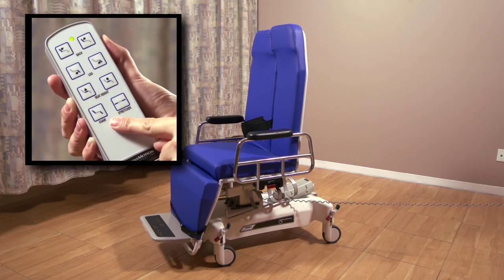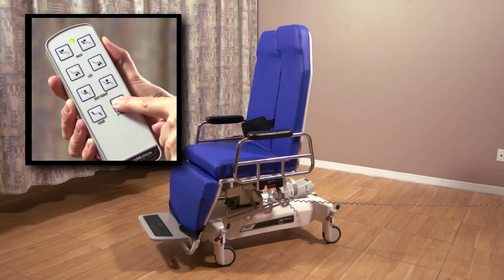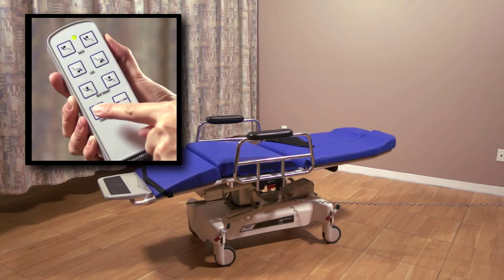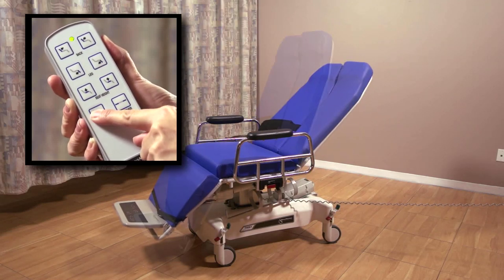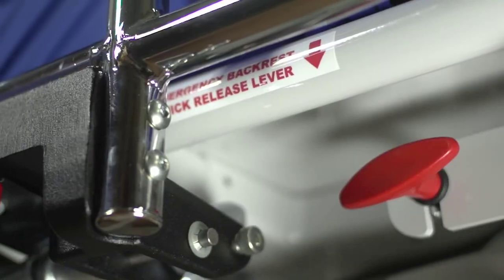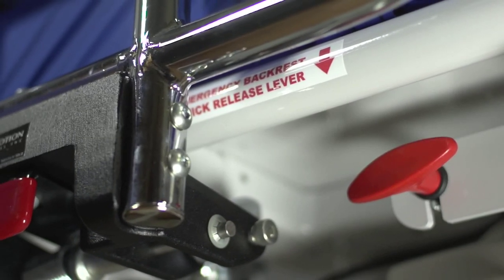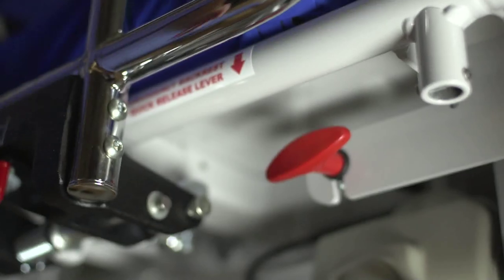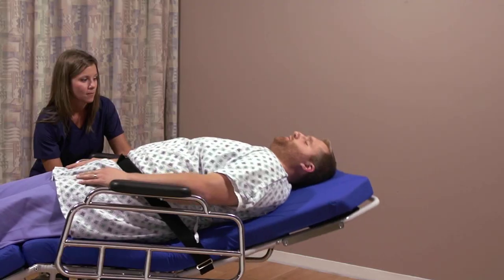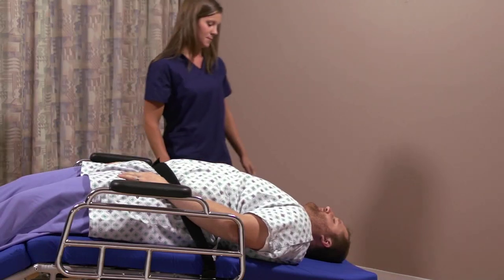The auto contour buttons simultaneously move the back and leg sections, letting you put the chair into a flat, reclining, or fully upright sitting position. The chair is also equipped with a manual quick release, located on the patient's right side. This release will quickly lower the back section of the chair in the event you need to perform emergency CPR.